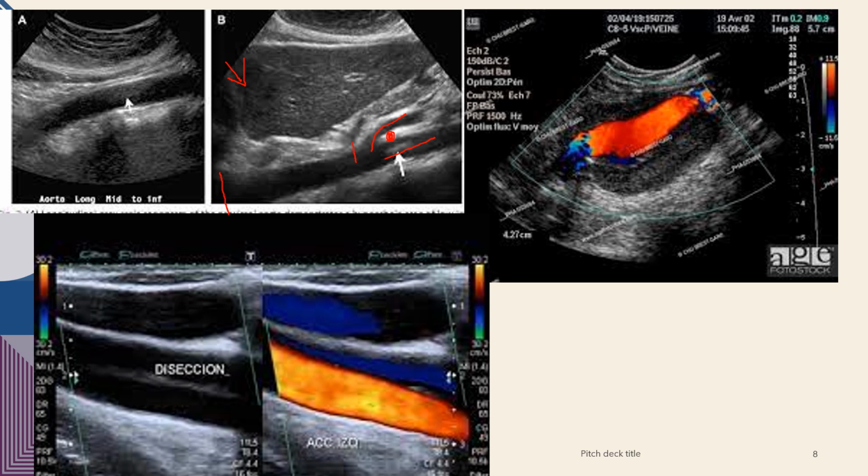Okay. As you progress inferiorly, you'll see that the aorta comes a little bit more superficial. And again, here you're able to make out those vessel wall lines a little bit better. So you'd want to measure transverse to the area there. And then you would follow it down to the taper as you saw on the last screen.